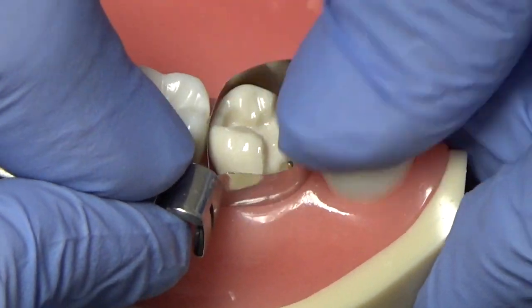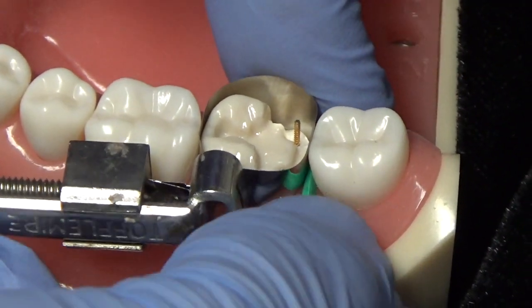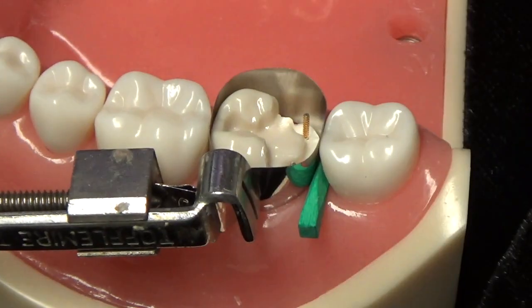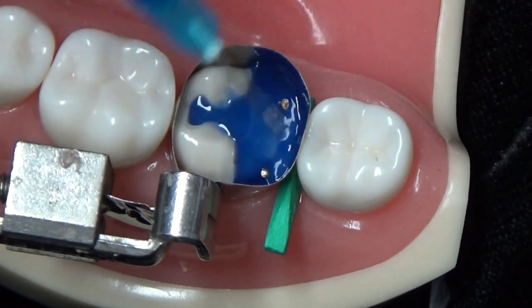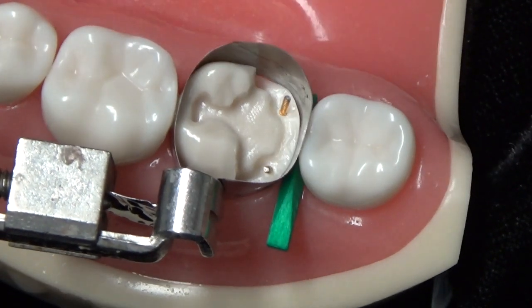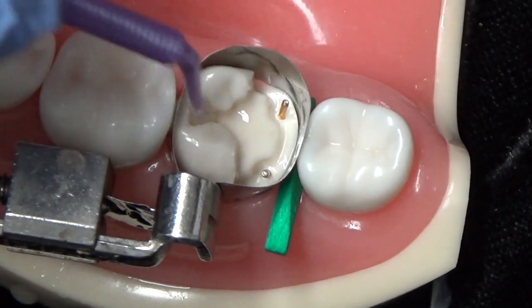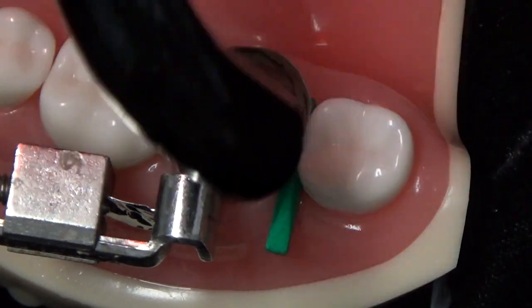Completion of the restoration involves placement of the matrix and wedging, followed by restorative material — whether it's composite or amalgam. In this case, since it's composite, we need to acid etch, wash, dry, apply the bonding agent, thin it out with air, and cure.